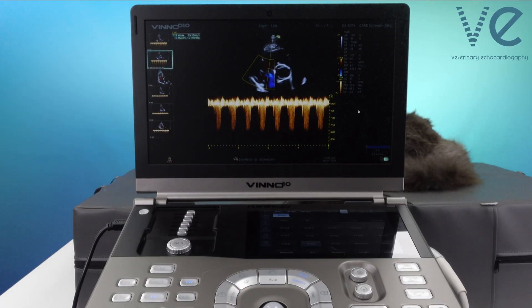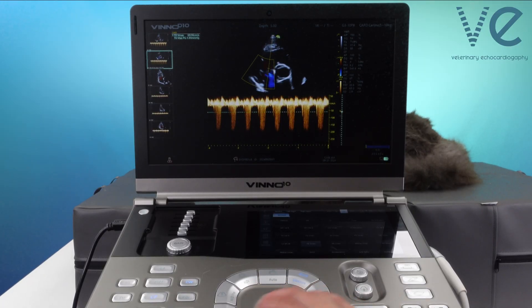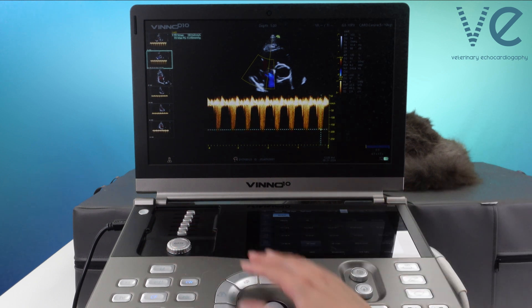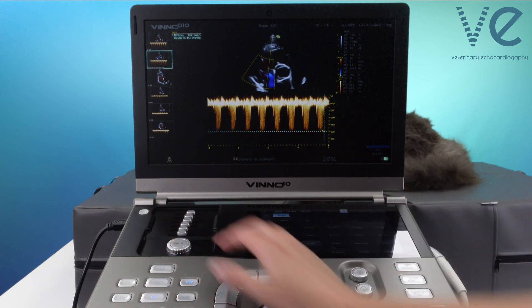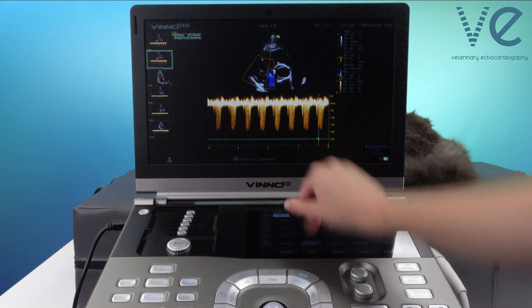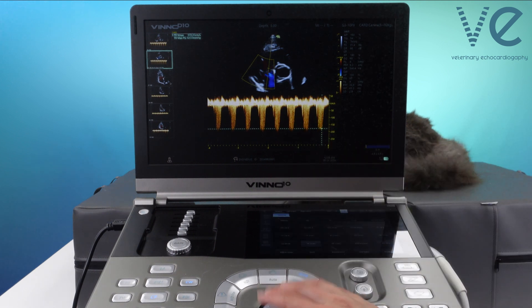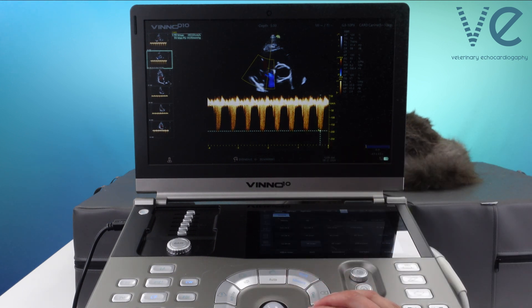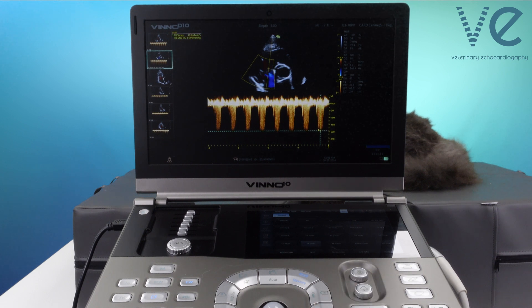When you come to measure your tricuspid regurgitation jet, you're just going to go to the peak. Don't imagine it to be greater than it is, and try not to measure the feathery bits right at the bottom. You're going to go to the highest velocity that you can truly see. In this case, it's 1.9 metres per second, which is a pressure gradient of 15 millimetres of mercury.